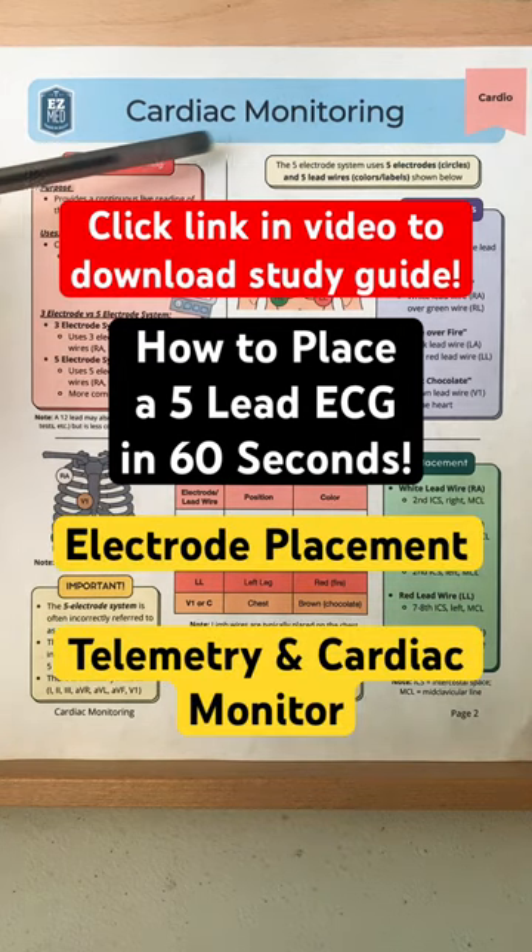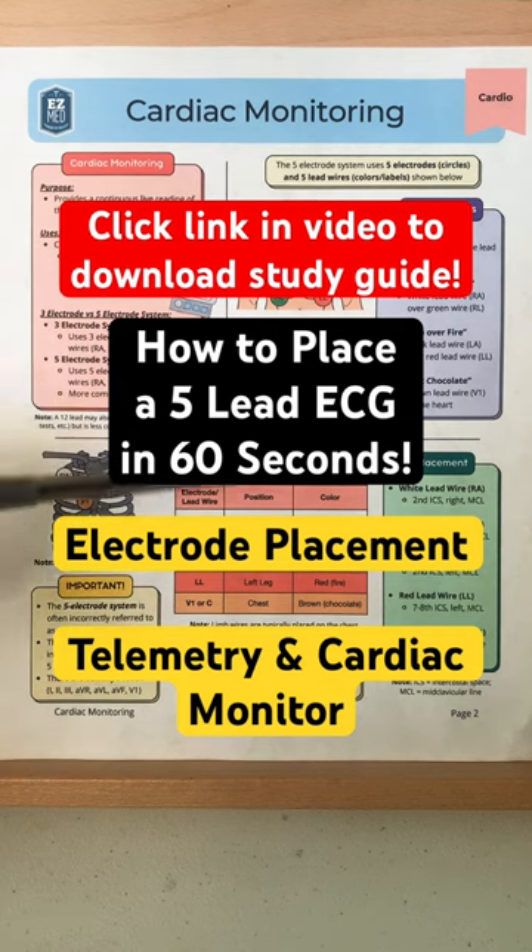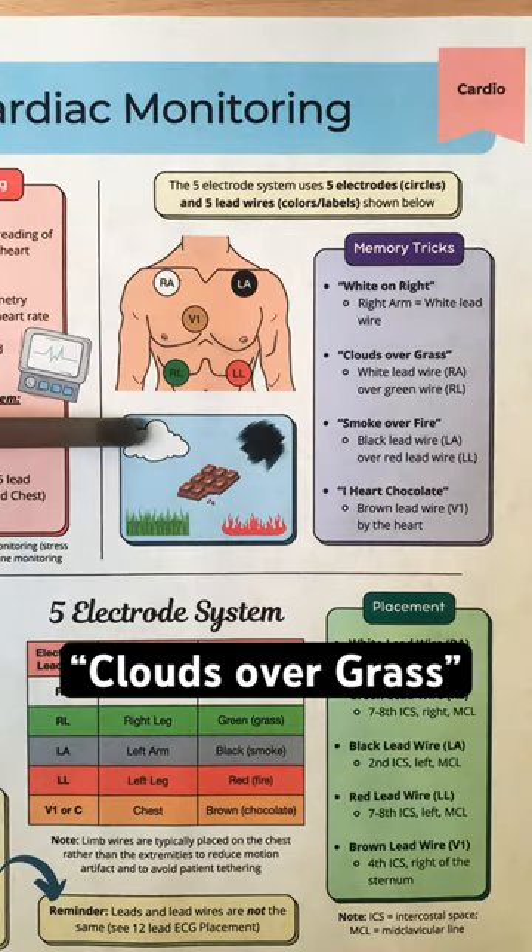How to place a 5-lead ECG in 60 seconds. These notes are great for electrode placement for telemetry and cardiac monitoring. First, remember: clouds over grass.